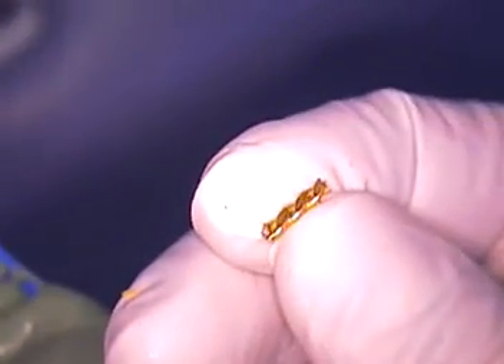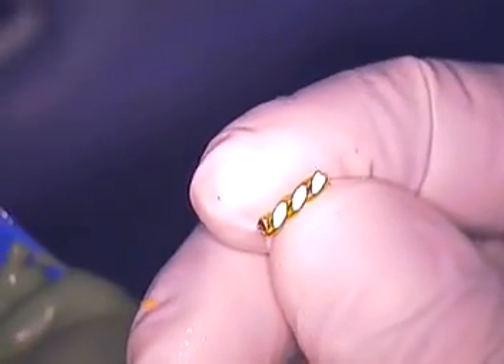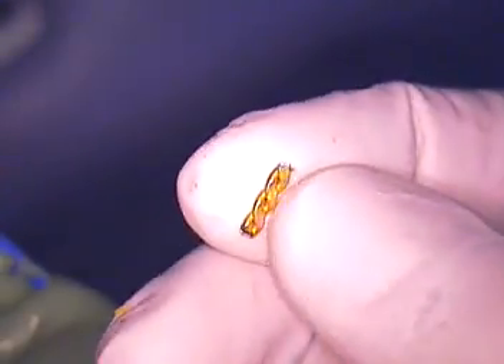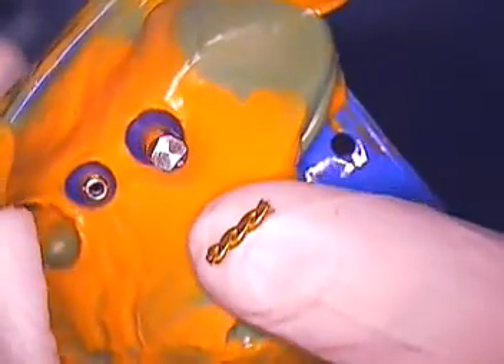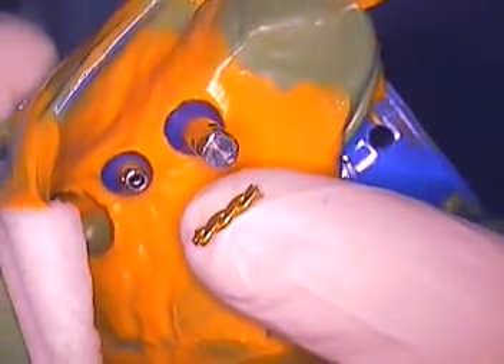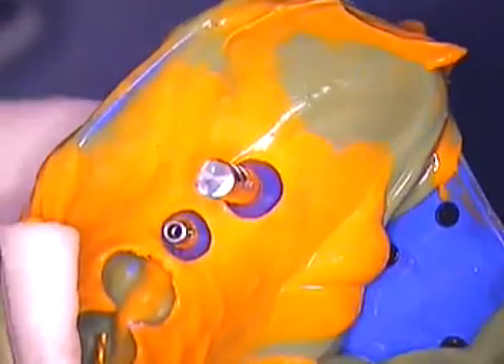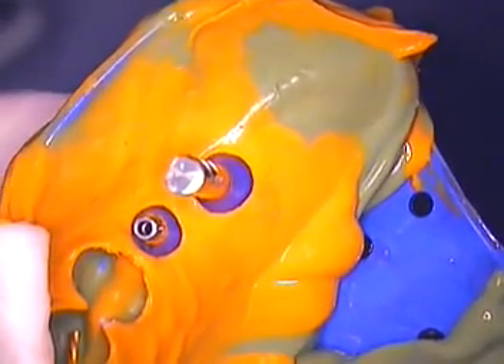Put out by the Keystone Company, these are coated to prevent any oxidation, and their job is to just keep things together. I'll use this piece, put two of them together — the same technique, same technology that I've used in the past on other videos — and put that all together.